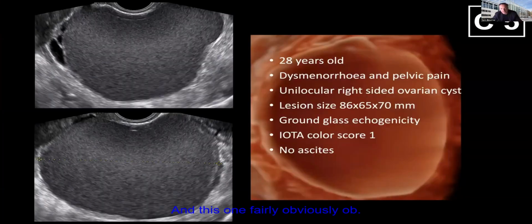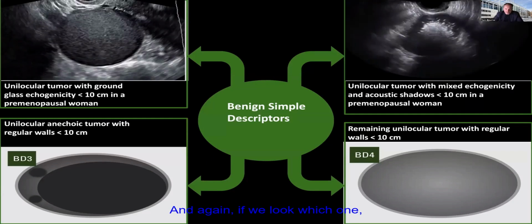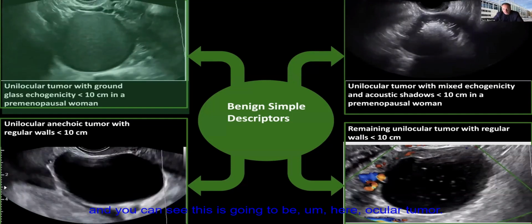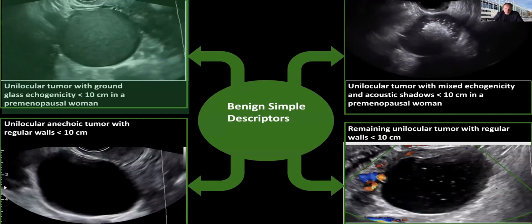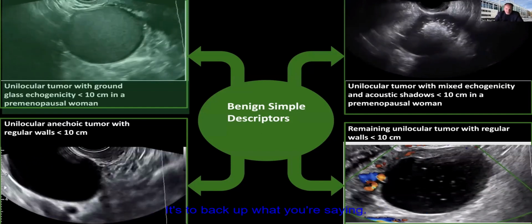And this one, fairly obviously, you can see this is going to be a straightforward endometrioma, classic history. And again, if we look, which one? You can see this is going to be here, unilocular tumour, and it was, of course, a benign endometrioma. So very straightforward, but it's good to have this data to back up what you're saying.